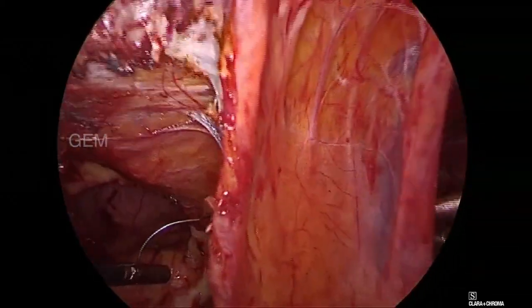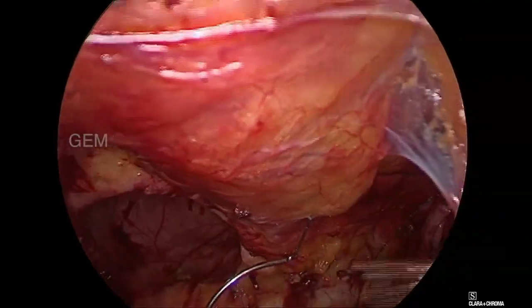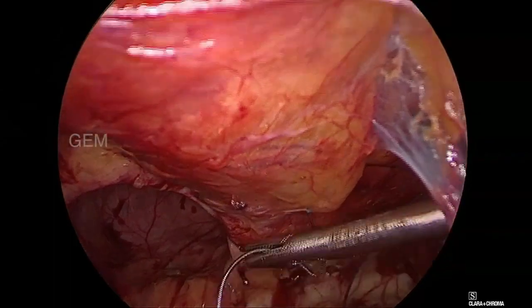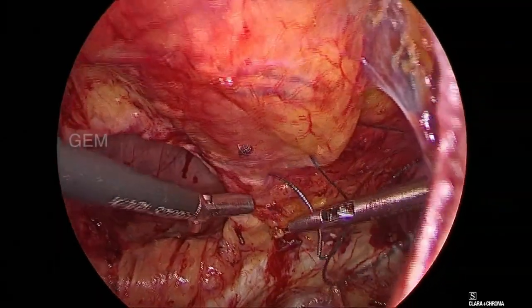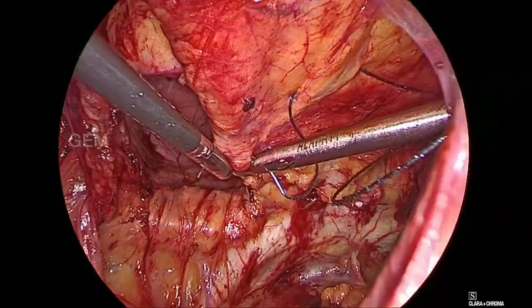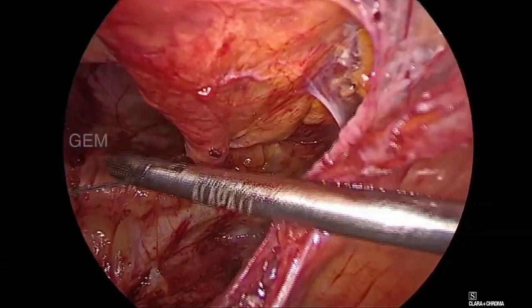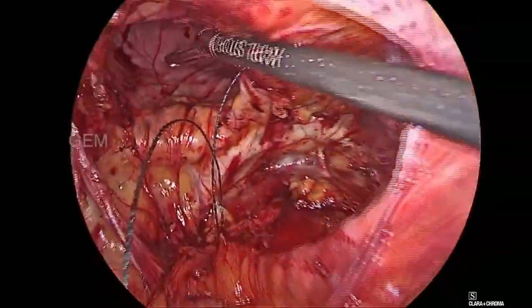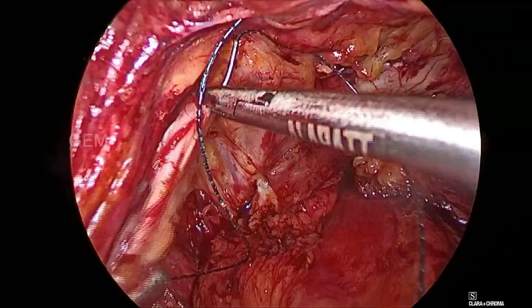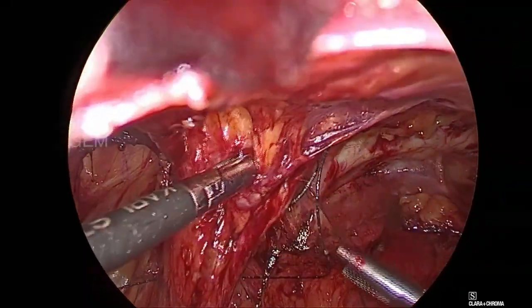Now we will try to plicate the left pseudo-sac circumferentially.